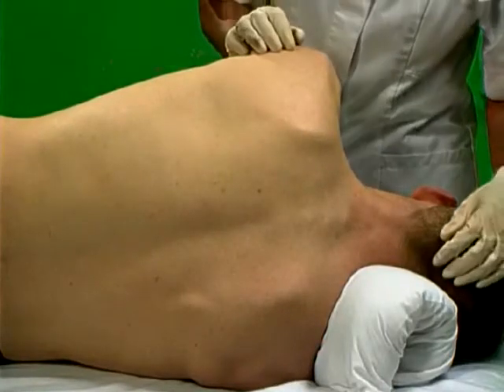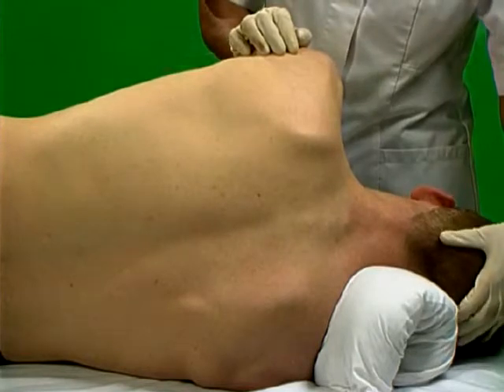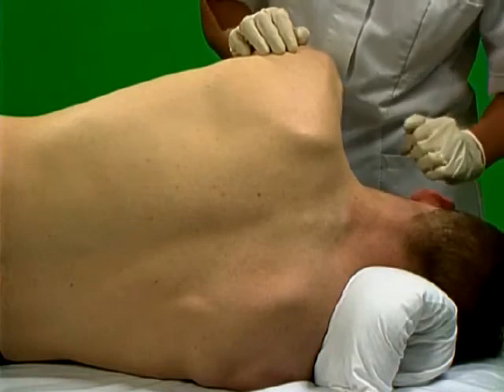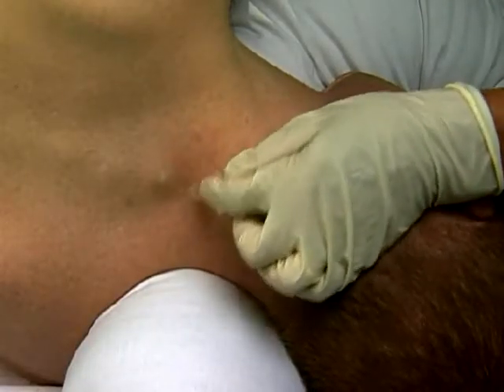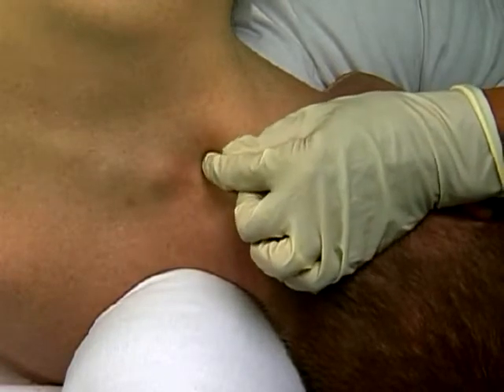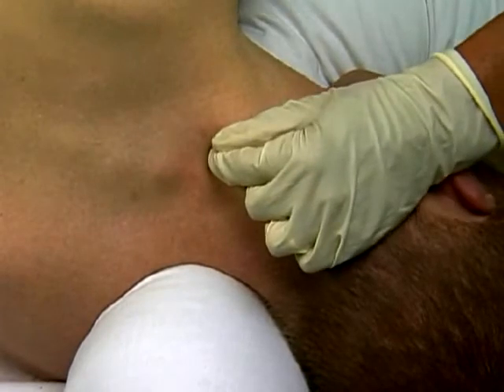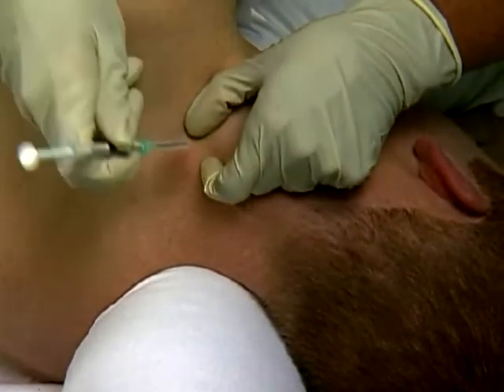The patient is in side lying with the neck in flexion and side flexion away from the painful side. Identify the spinous processes and the tender facet joint. Mark the entry point, one finger distal to this joint. Clean and firmly stretch the skin and rapidly insert needle perpendicularly.